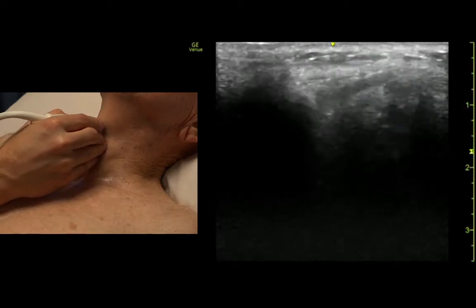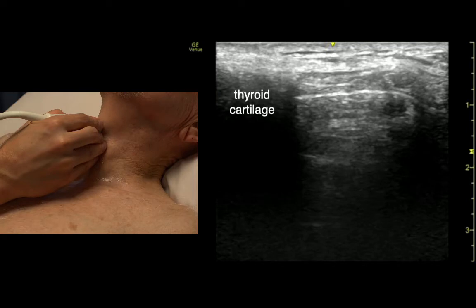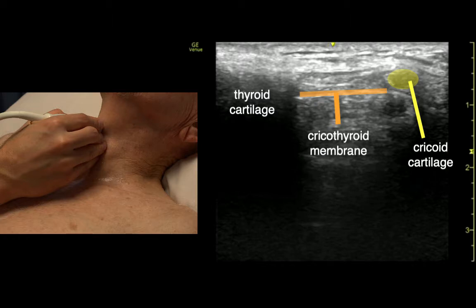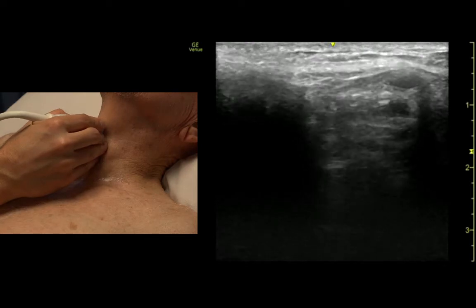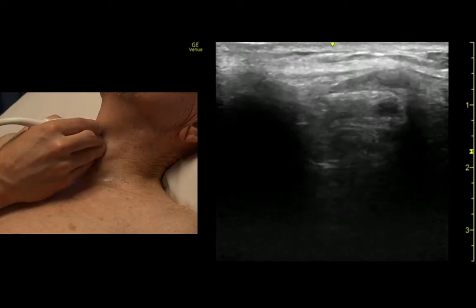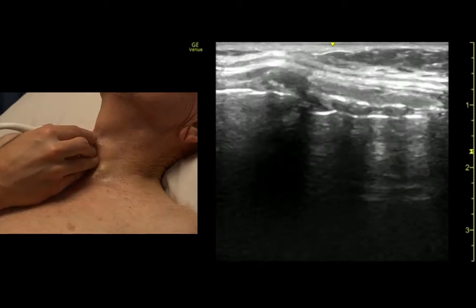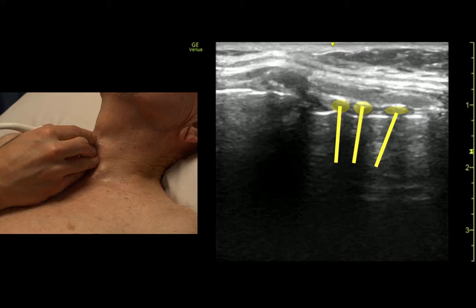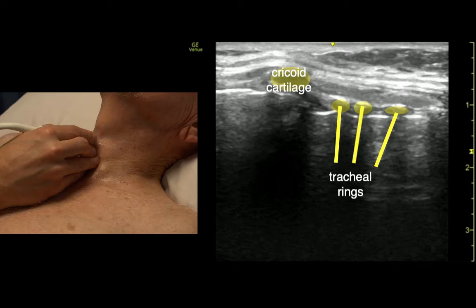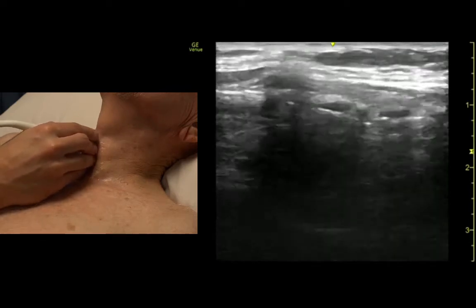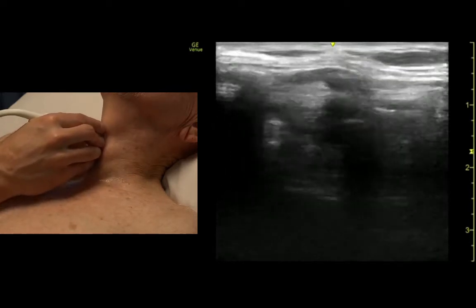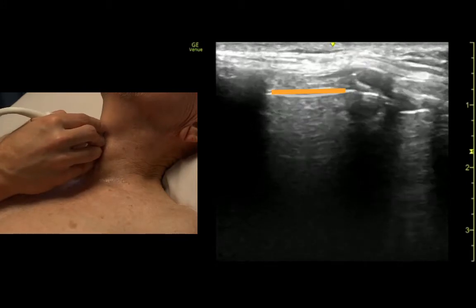Here's the longitudinal view of the trachea. We can see the thyroid cartilage here and the cricoid cartilage here — so this is where we want to make our incision. If we come lower on the trachea, we can see the tracheal rings, which all shadow a little bit. If we find those first and follow up, we see the big one — that's the cricoid cartilage. There's the thyroid cartilage, and there's our cricothyroid membrane.